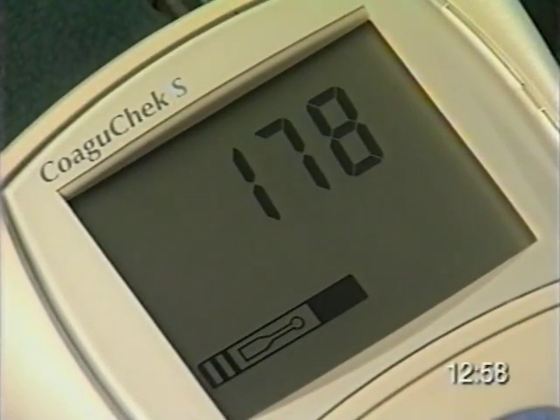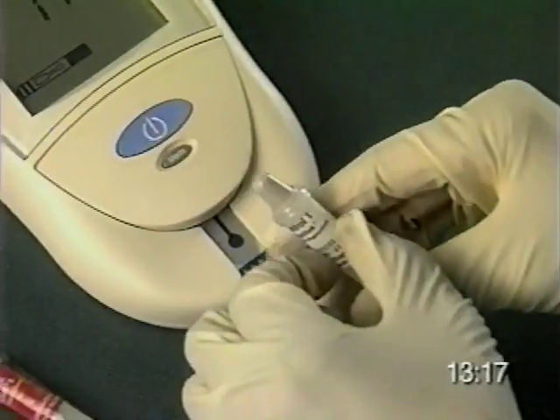After about 25 seconds, a flashing drop of blood appears, and the clock begins a countdown from 180, indicating that I have 3 minutes before the monitor automatically shuts off. The monitor will beep every 30 seconds until the drop is applied.